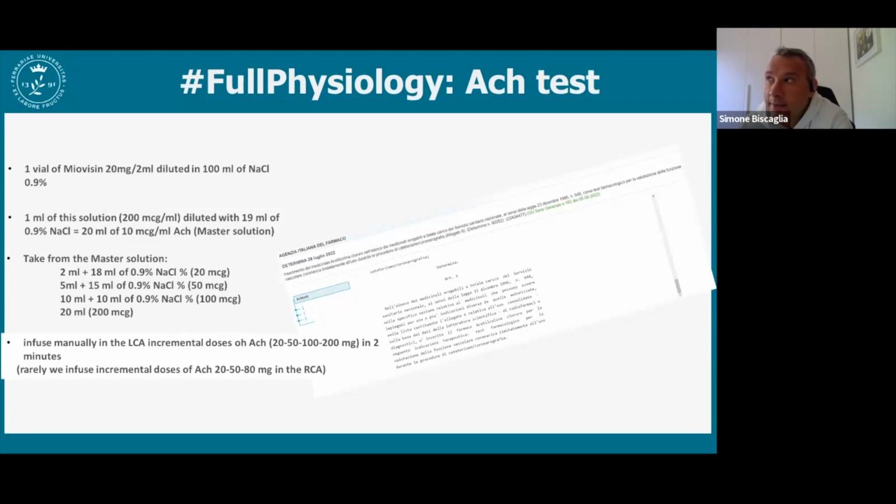And then the other thing you have to take into account is that when you have also an occlusive spasm with the usual nitro that you perform in each case, it will respond very, very well. So you will have the complete resolution of the spasm within seconds. So it's not something that will last long when you have a positive test. As soon as you perform nitro, you have always to remember to have nitro on the table, not to start thinking about nitro when you see the occluded coronary artery. But otherwise, it's a very safe evaluation.